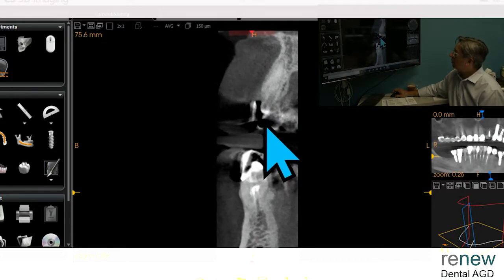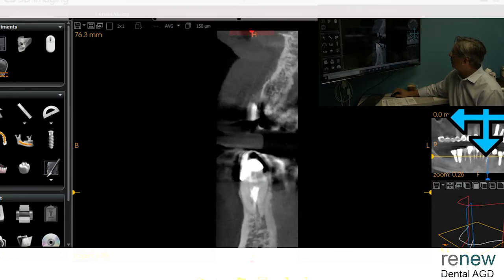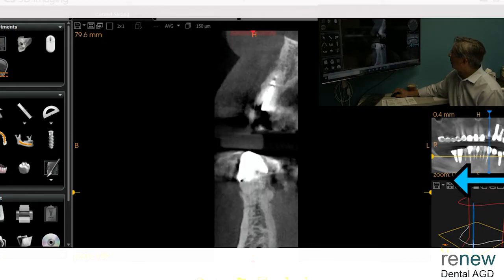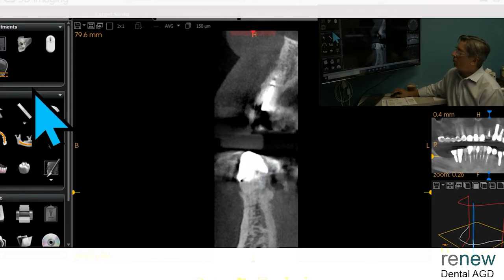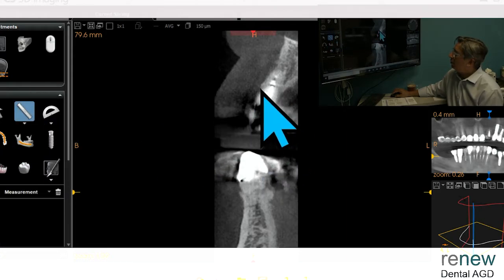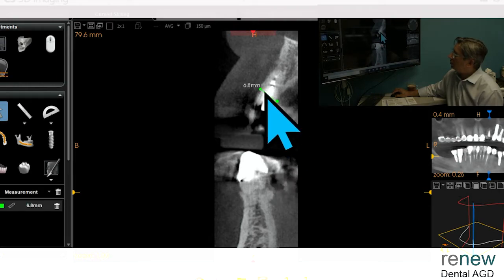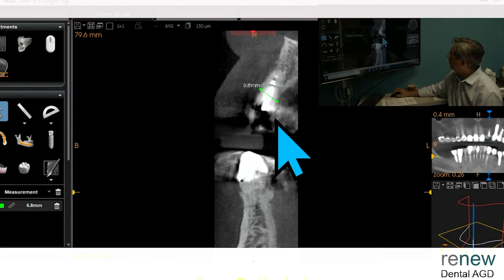Let's go to the lateral that we're actually going to look at here. So that would be right here. And yeah, this tooth is fractured off. We do have a bony line right here to right here. This is split, so the bone is going away at a little bit of the top.